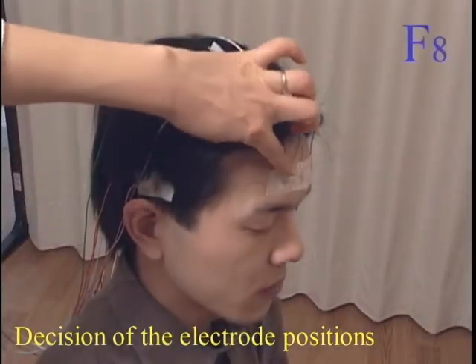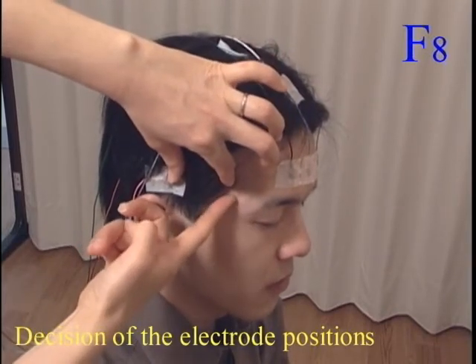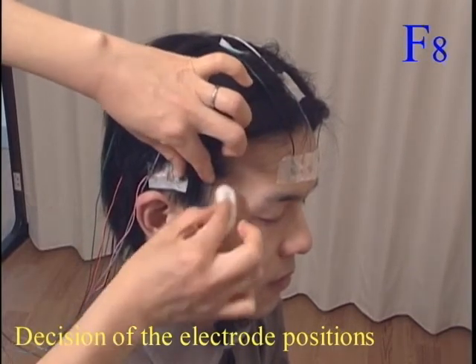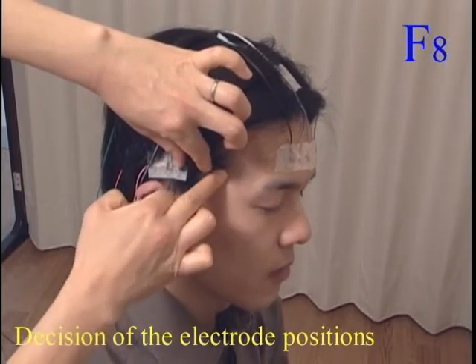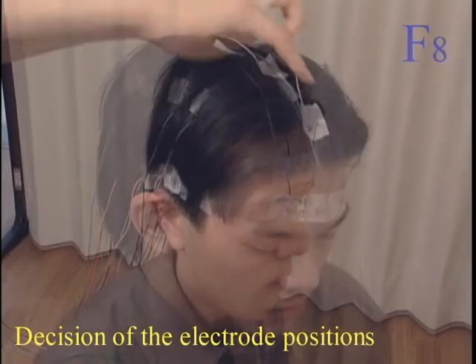F8 is the midpoint between FP2 and T4. Here we assume the patient to have temporal lobe epilepsy and shift the electrode 1 centimeter downwards and 1 centimeter backwards. Apply F7 by the same procedures. However, please remember the positions of F7 and F8 before the shift.